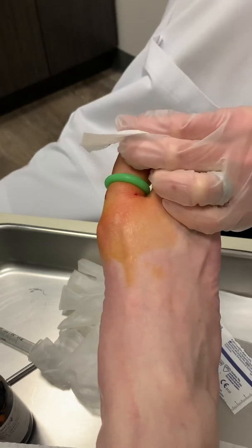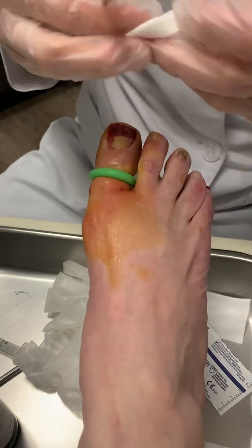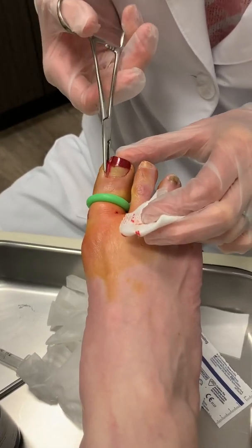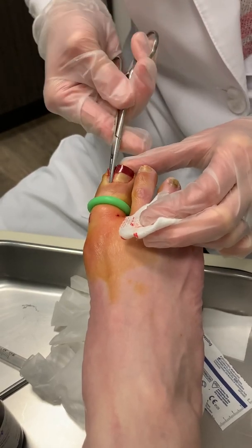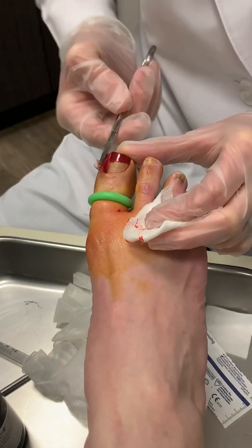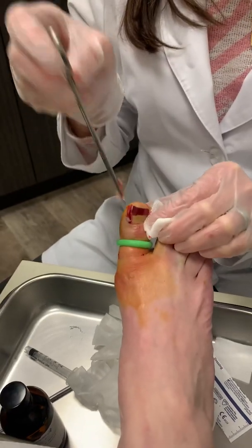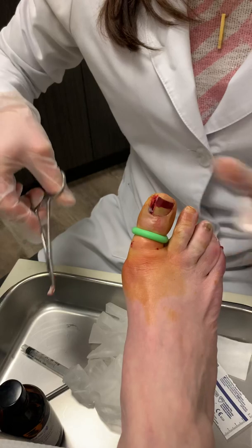Then you take a hemostat and go right down this nail edge, and I clasp onto it and then you roll out — and you can see all of the nail that was underneath the skin fold that we couldn't see with the visible eye, which is why the patient was infected and was hurting quite a bit.